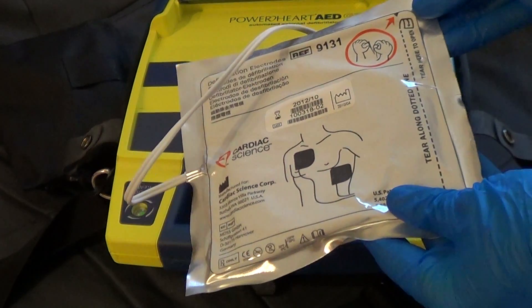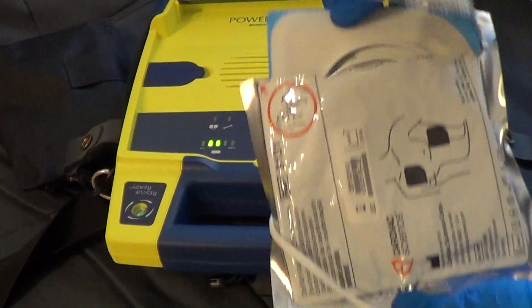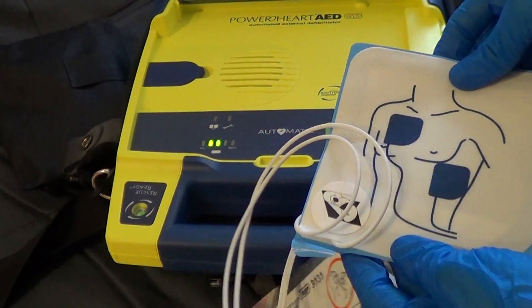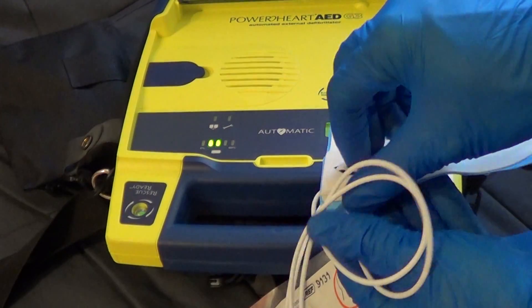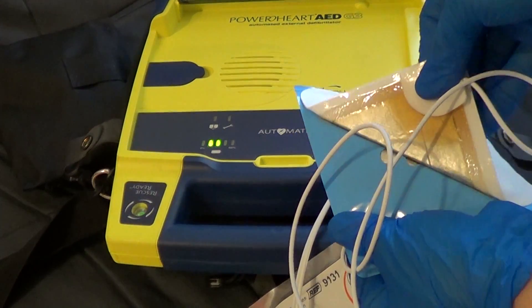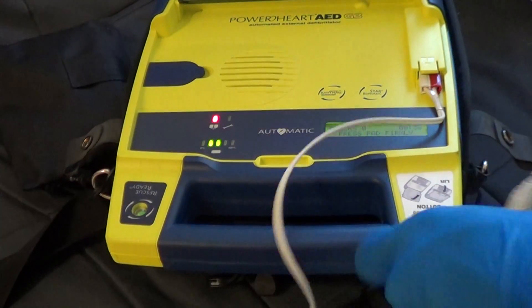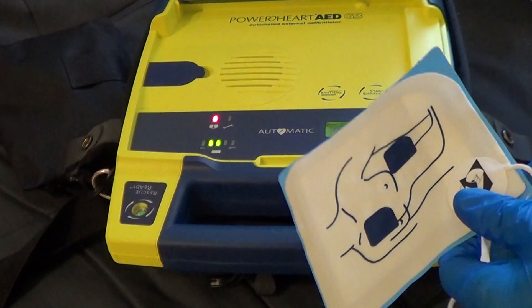Tear open the foil package across the dotted line and remove the pads. Next, separate one of the white pads completely from the blue plastic liner, beginning to peel from the tab corner.